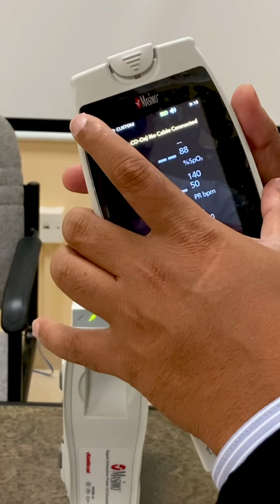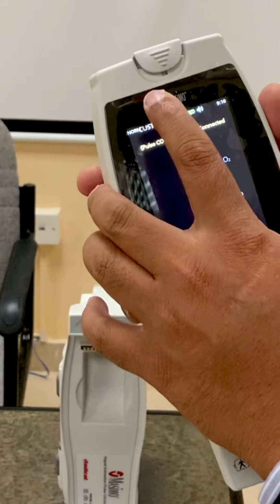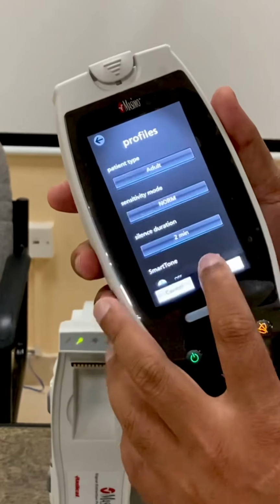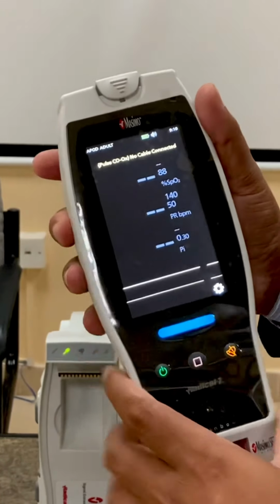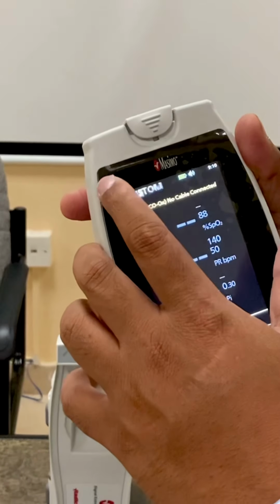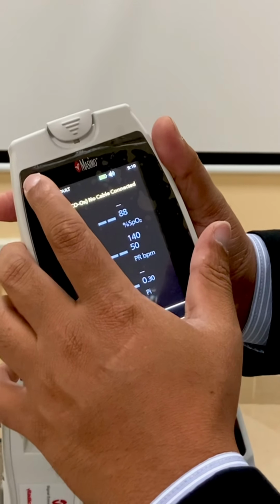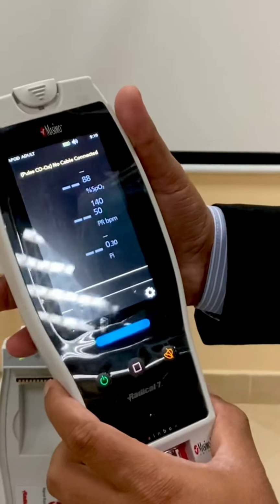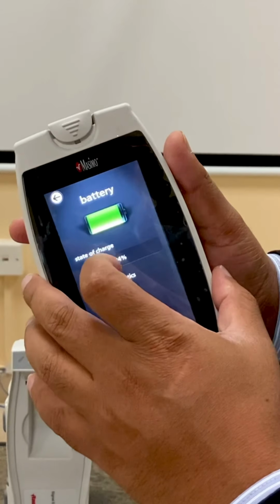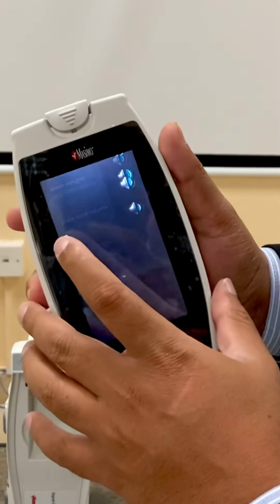Then go here, you can see a port. Just press on that one, so it will move to normal. But again, it should be adult. Now you can just press to know the battery status. This is for alarm silencing.